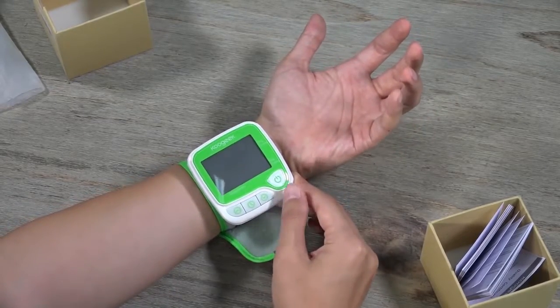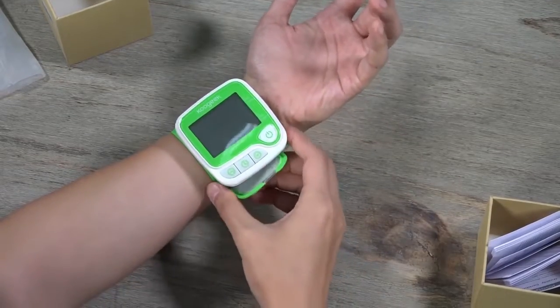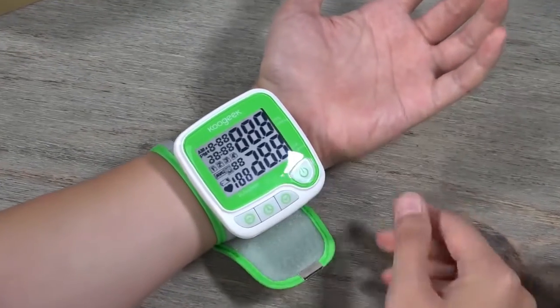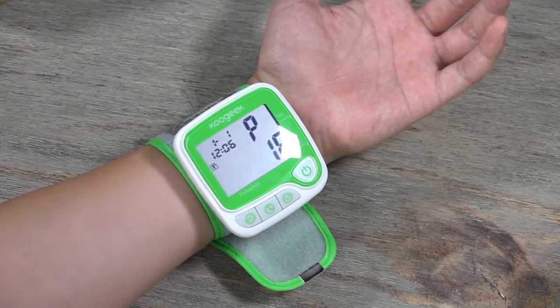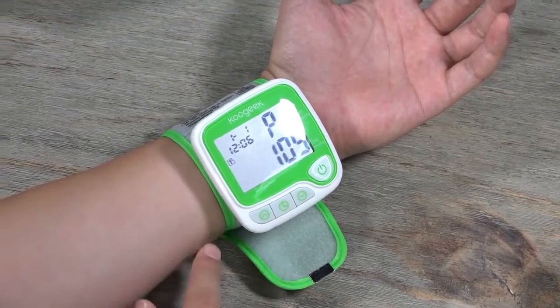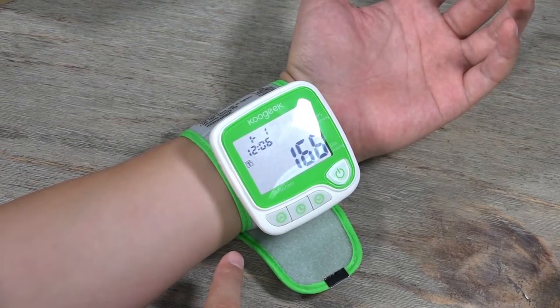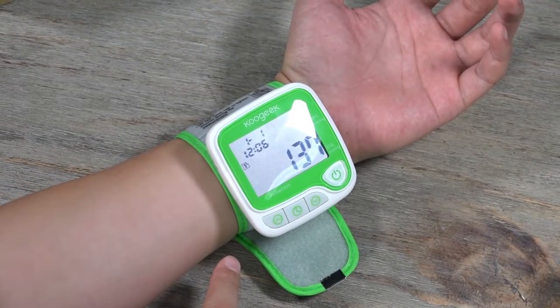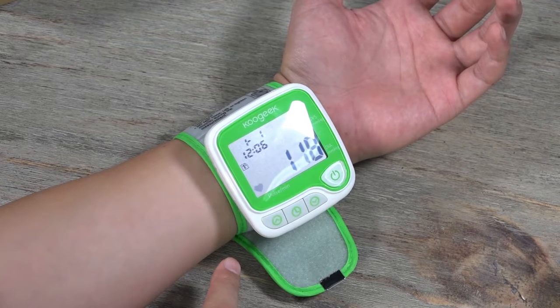There are four buttons and it's very easy to use. When you make sure it's on the inside of your hand, press this button. It will start inflating air into the band, and when it's ready it will be monitoring your blood pressure, heartbeat, and other parameters.